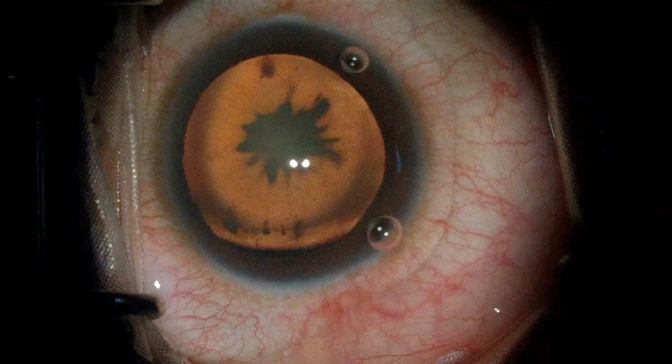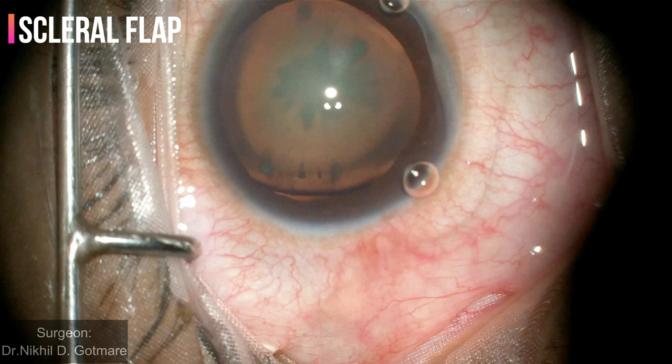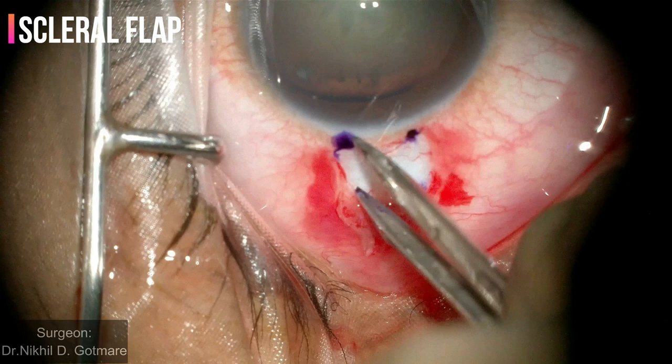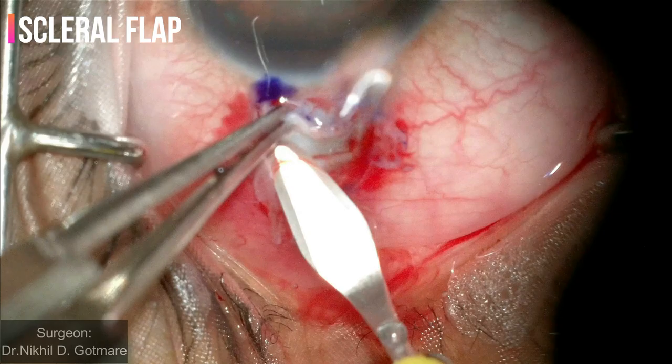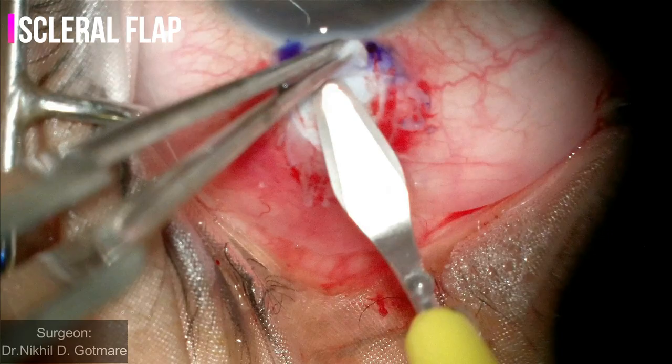The first step is to make a partial thickness scleral flap in the area of maximum subluxation. In this patient, the subluxation is from 7 o'clock to 11 o'clock, so I will be making a flap in the center at 9 o'clock. Conjunctival peritomy is done, bleeders are cauterized. A trapezoid scleral flap of around 3 mm x 3 mm is made using a green blade, followed by a crescent blade. I am sitting temporally during this step so that creating the flap becomes easier. Once the flap is ready, I shift to the superior position.